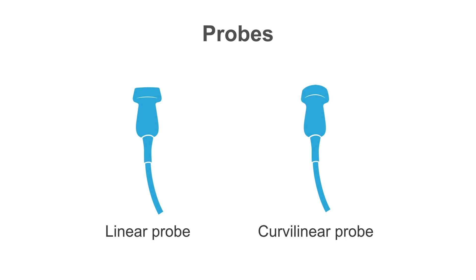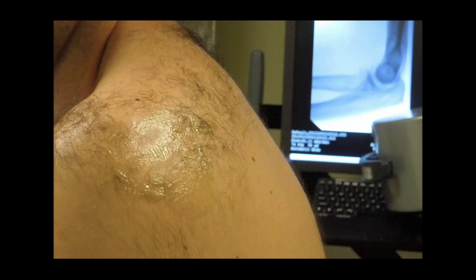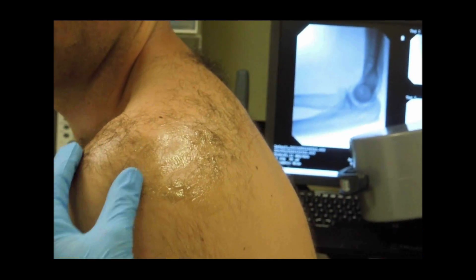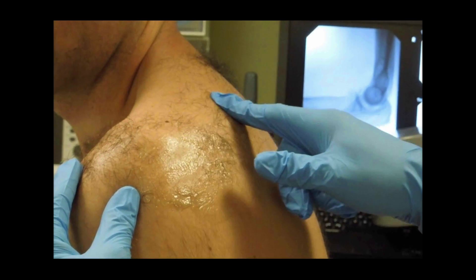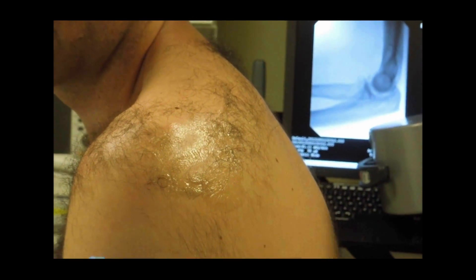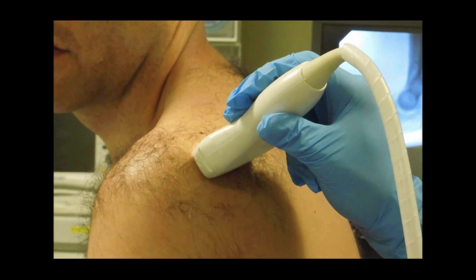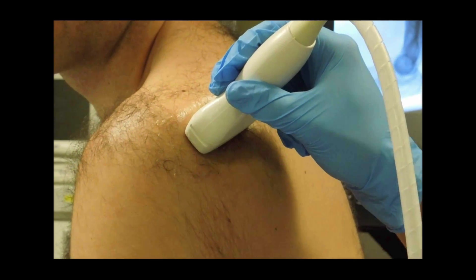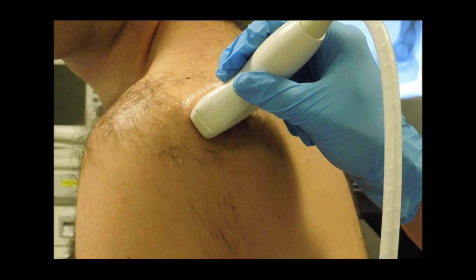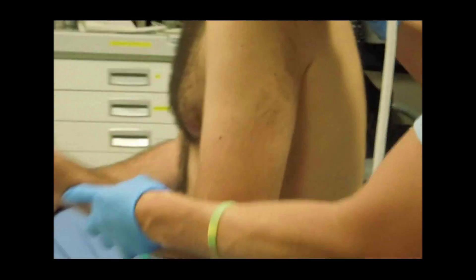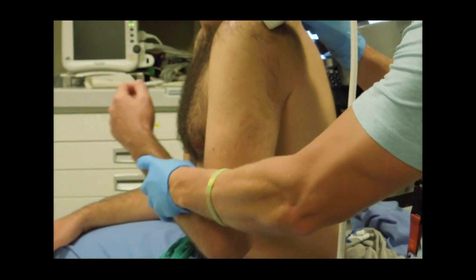So let's look here at where our probe is on our patient. To orient you, the patient's head is here facing forward. The back is here to the right of the screen. You can see gel is already applied to our target area here. Watch as your operator identifies the scapular spine. The probe is going to be placed directly on the spine and then moved downward. You'll see here as your operator internally and externally rotates the shoulder.